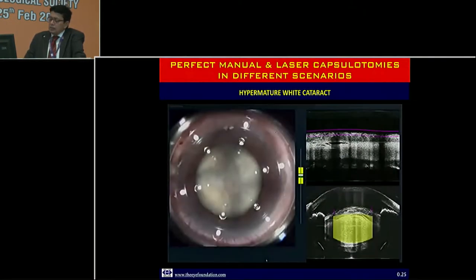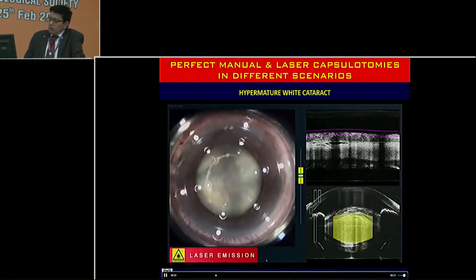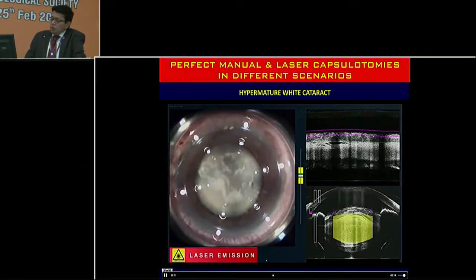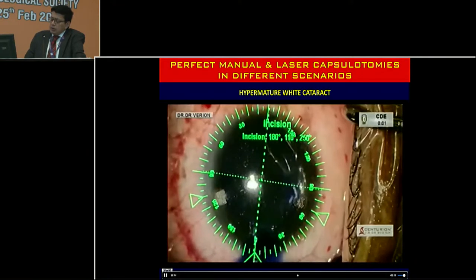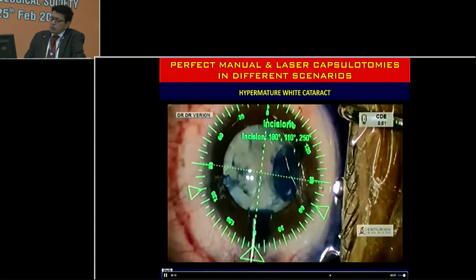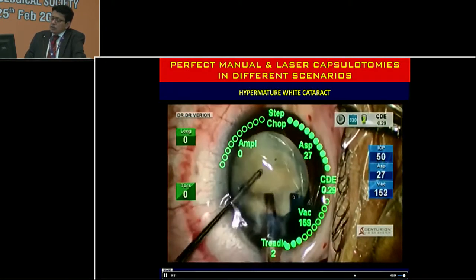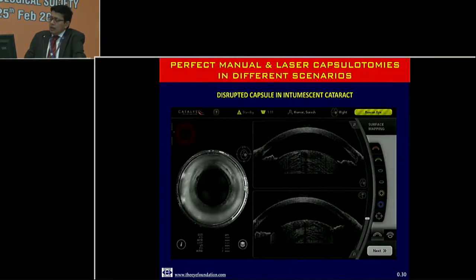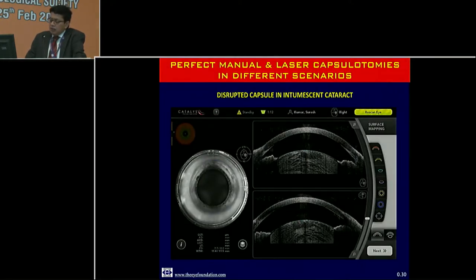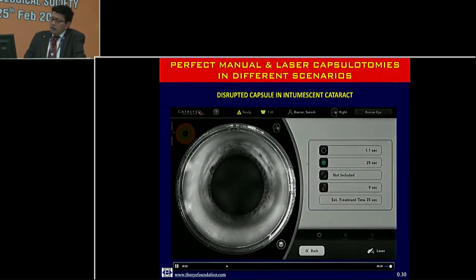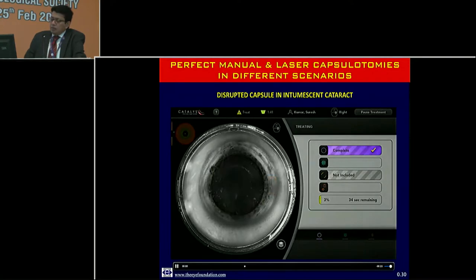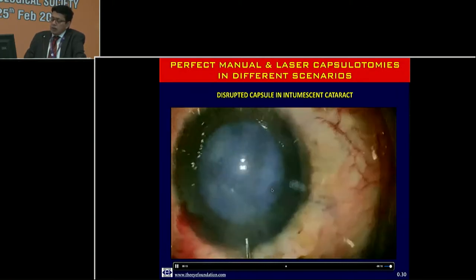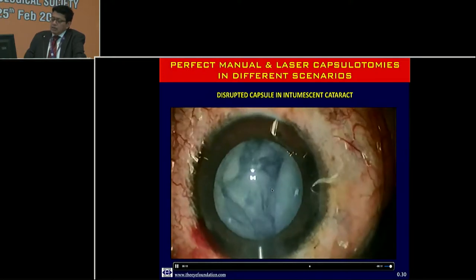The greatest application of the femtosecond platform is in capsular rhexis, essentially for intumescent white cataracts, where you get a repeatable, free-floating rhexis. However, it is not always perfect — even with this platform, in an intumescent cataract an even faster platform that creates the rhexis in one second can produce a totally disrupted capsule due to sudden surge of fluid — interlenticular fluid flowing out can cause a rhexis run-off. This happens rarely but can occur.